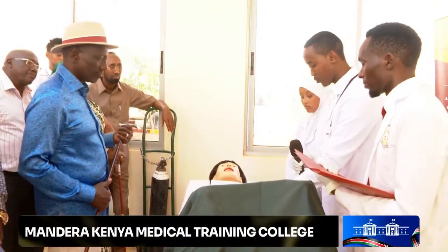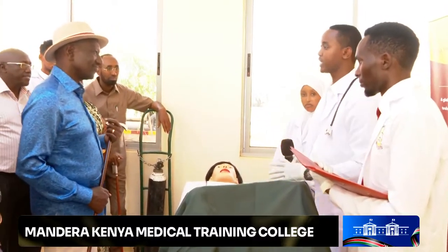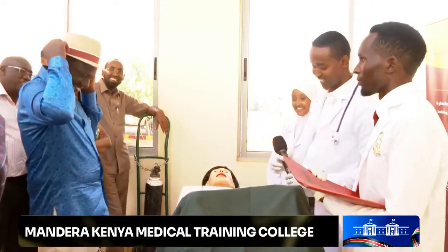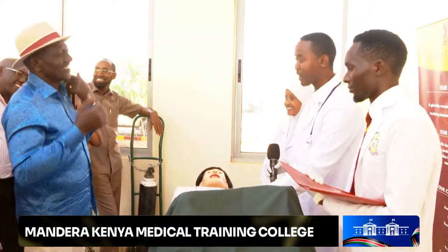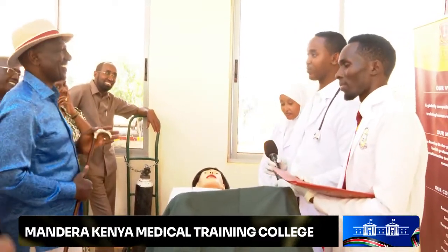So we have the equipment here. We are covering the patient as a result of the exposure of private parts to so many people. So as a result of privacy, we covered it. But the catheter is in situ. It is in place, which we have done properly.